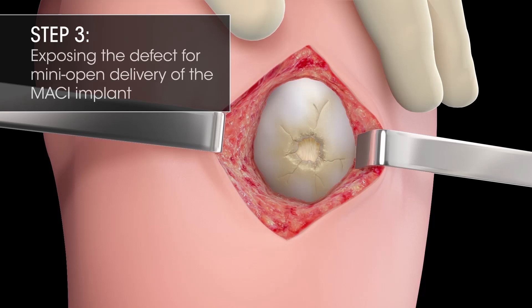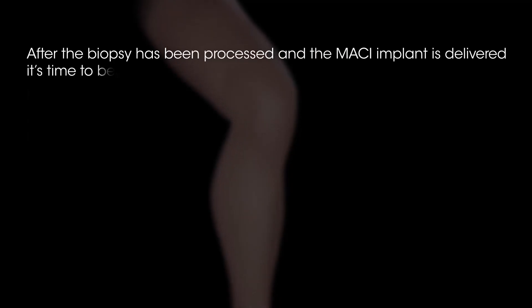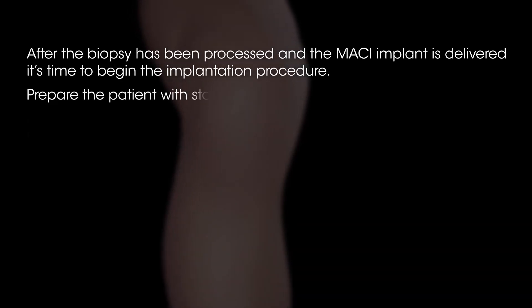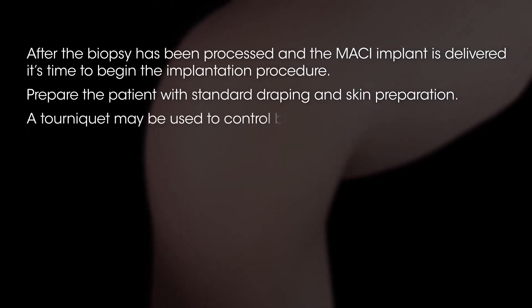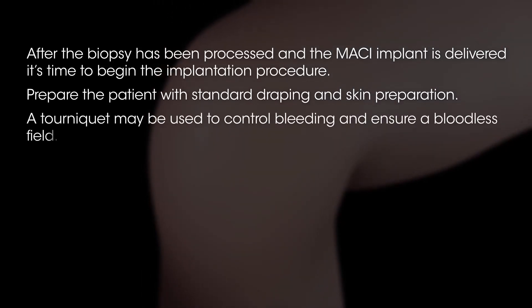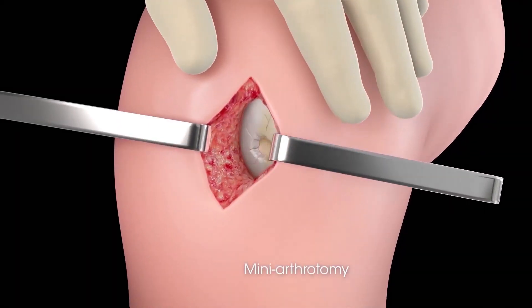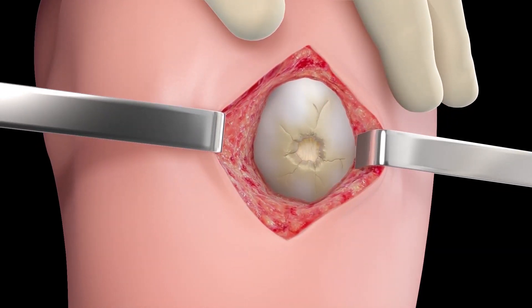Step 3: Exposing the Defect for Mini-Open Delivery of the MACI Implant. After the biopsy has been processed and the MACI Implant is delivered, it's time to begin the implantation procedure. Prepare the patient with standard draping and skin preparation. A tourniquet may be used to control bleeding and ensure a bloodless field. Perform a mini-arthrotomy based on location to fully expose the defect, and keep the skin retracted in order to gain access to the defect area.